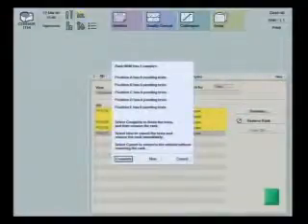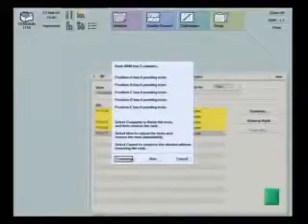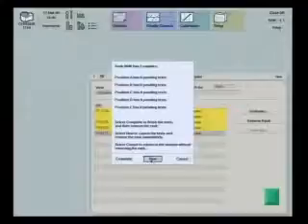To remove a rack to add more sample, remove a clot, or to reposition a sample tube, select the sample and then remove rack. When prompted, select Completed or Now. If you select Completed, the rack will be removed to the sample exit queue when all other samples in the rack have been aspirated. If you select Now, the sample rack will be removed ASAP, and some of the samples on that rack may not have been aspirated.